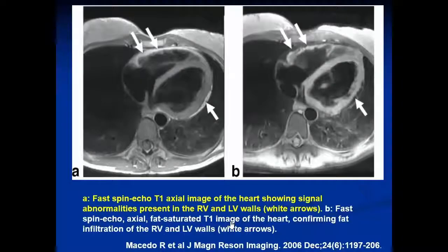The classic cardiomyopathy that has been addressed by MR for decades is arrhythmogenic ventricular dysplasia. And arrhythmogenic ventricular dysplasia generally is not, opposite to sarcoidosis, quite rare. So what you're going to see the most is people with question ARVD, and in the end, it's not going to be ARVD. But how should you think of ARVD?